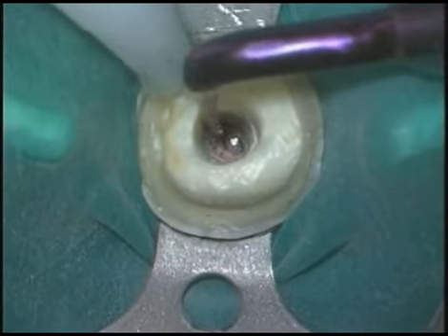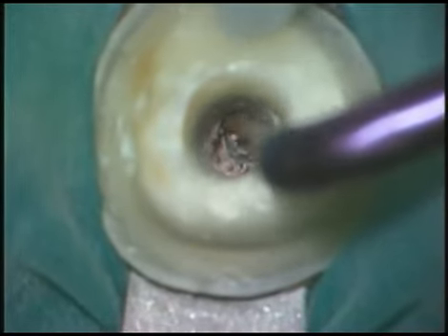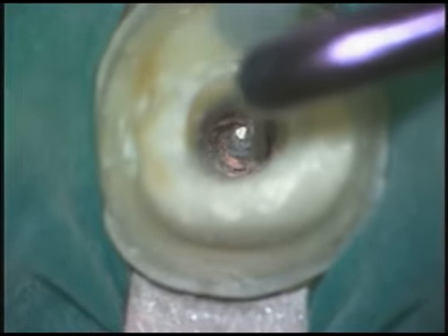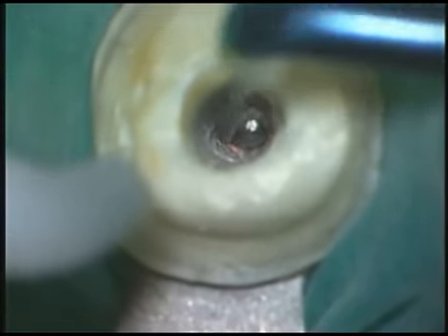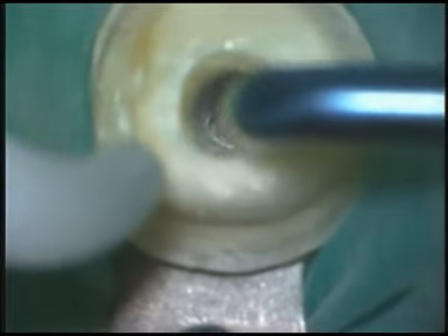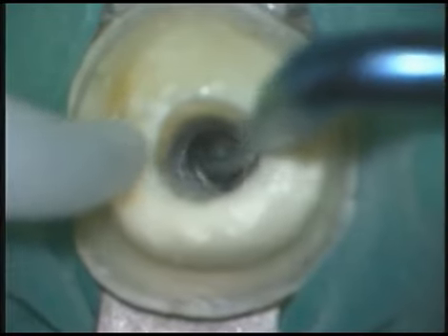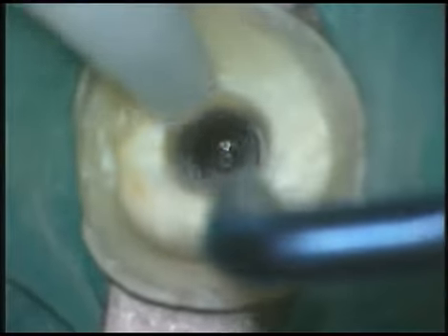This is a nickel titanium file, and you can begin to see it move, and at higher mag, you can see the cutting action is progressively freeing up the head of the instrument. Ultrasonics is always performed cutting dry. We don't use water because water, in the presence of debris, would form a sludge or a slurry which would block our vision. The Stropko very efficiently blows this debris out, which keeps our vision on the obstruction at all times. This keeps us centered in the root and prevents us from performing iatrogenic events.